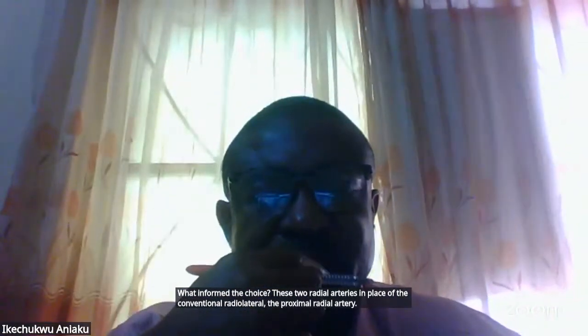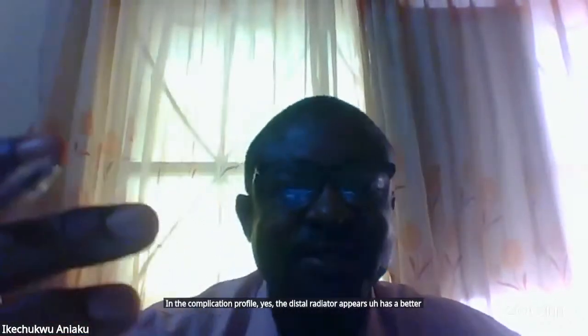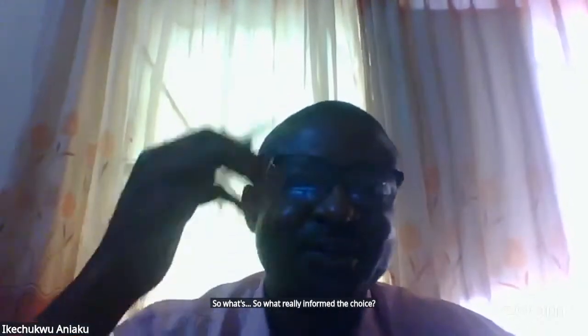The conventional radial artery appears wider and easier to cannulate, while the distal radial artery is convoluted because it passes through the anatomical snuffbox. The distal radial artery appears to have a better complication profile, but what really informed the choice of the distal radial artery in this procedure?